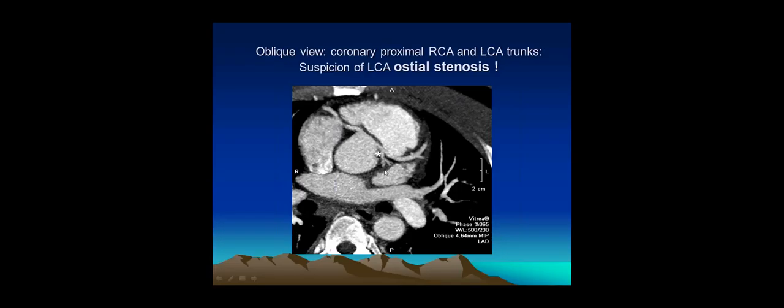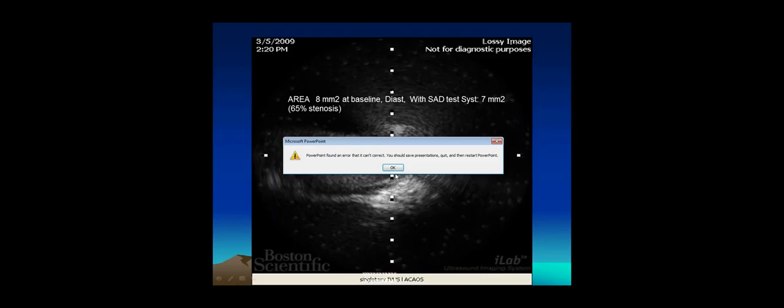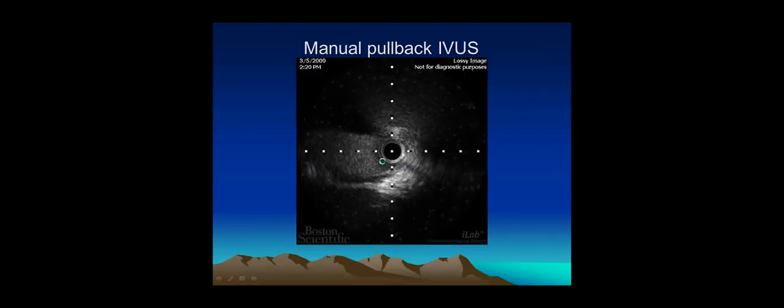Yeah. It's hard to tell. The ostium is probably here, right, but it's slit-like, so it's extended. Okay, this is the picture of the ostium, and this is a movie? No. The previous movie?